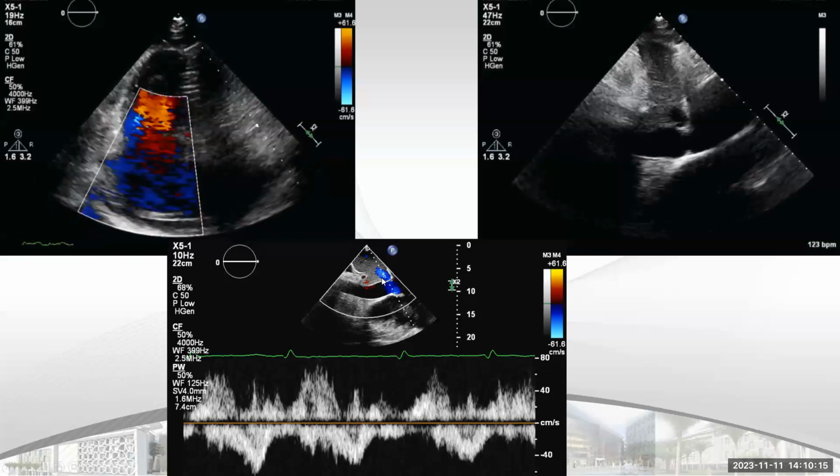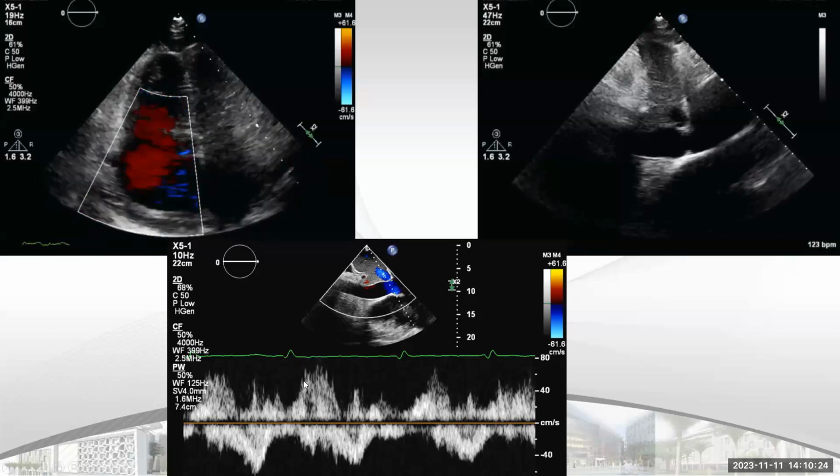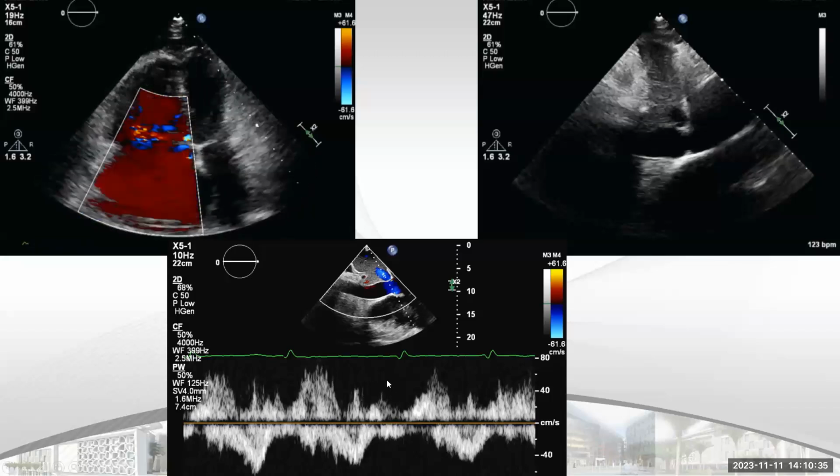The hint is that in the hepatic vein we have systolic reversal, timed with the ECG, and you see this is immediately after the QRS. So this is in systole. If you have systolic reversal of the hepatic vein, this is an indication of severe tricuspid regurgitation. If you have diastolic reversal, this is an indication of significant pulmonary hypertension, at least moderate. And it's very common to have both, systolic and diastolic reversal. That means you have a combination of severe tricuspid regurgitation and significant pulmonary hypertension, which is a very common association, mainly because of the pulmonary hypertension, which is complicated by severe TR.